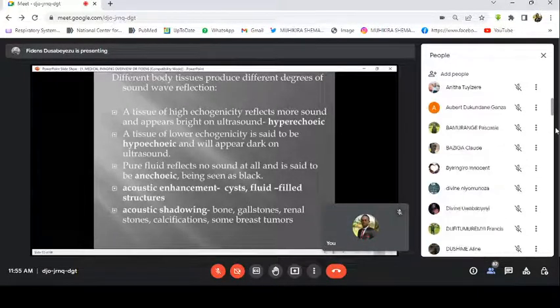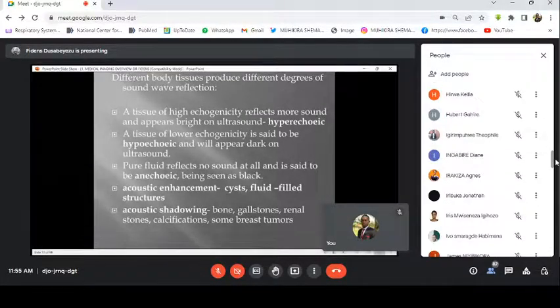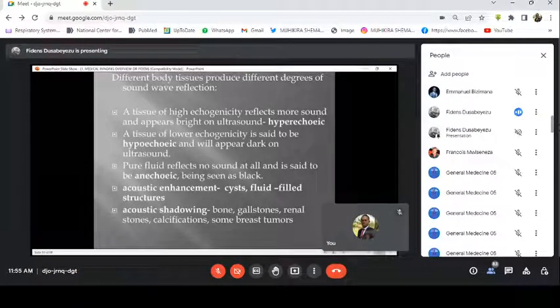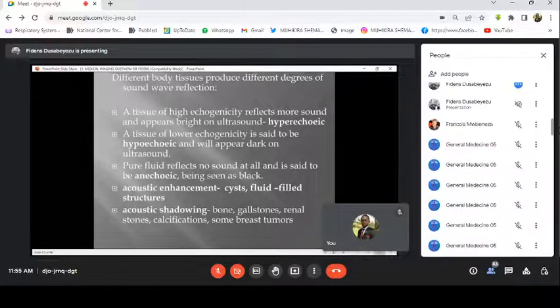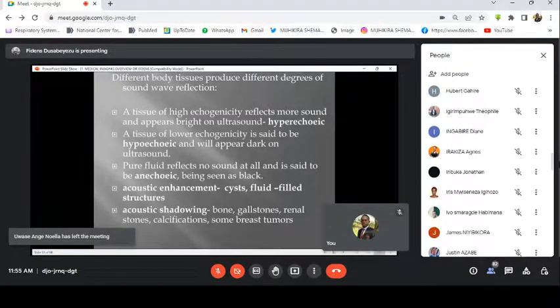A tissue of high echogenicity is a tissue that reflects more sound and appears bright on ultrasound. Can we understand this statement? Yes. Come back.